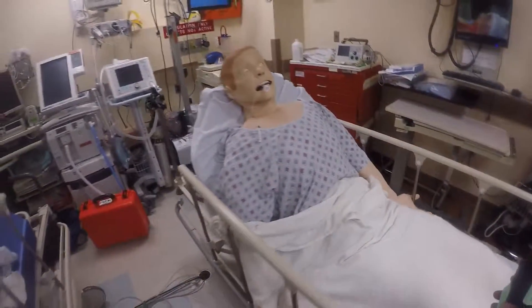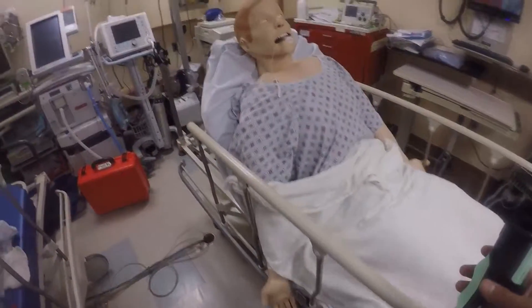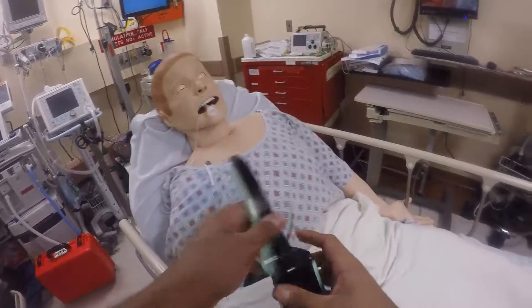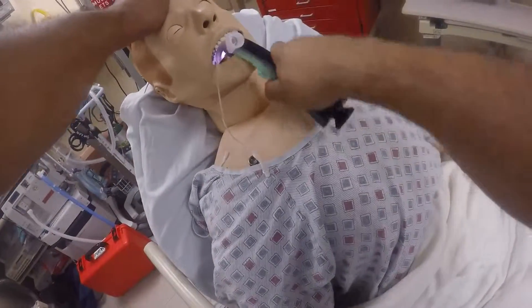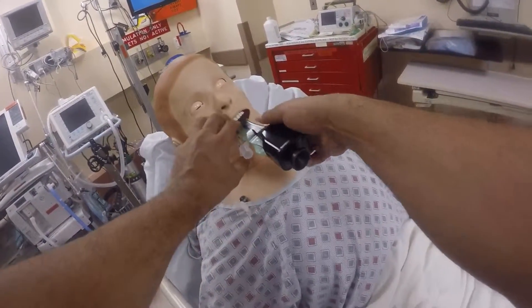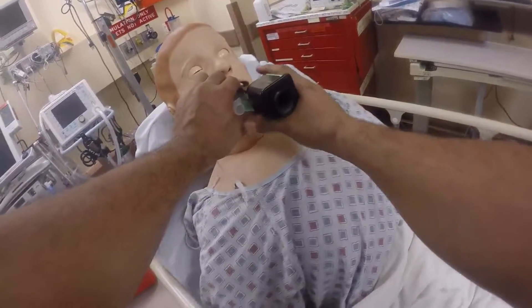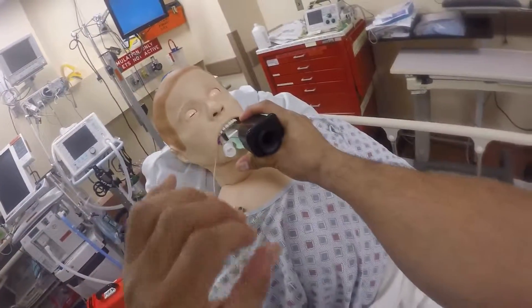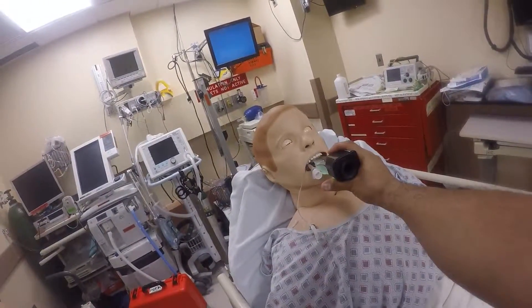It doesn't look that hard. With another device for the Tomahawk method, you just have to pull — make sure when you enter, you pull anteriorly. People say they're afraid of hurting the patient, but pull a little harder to open things up and pass the tube.